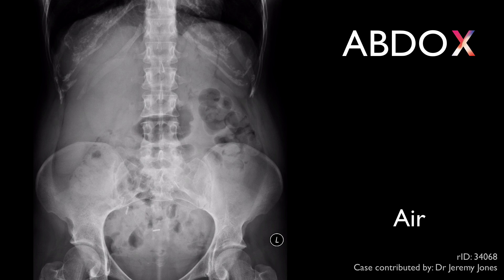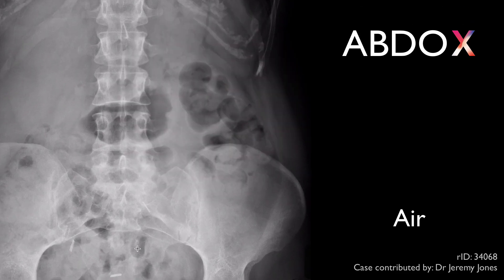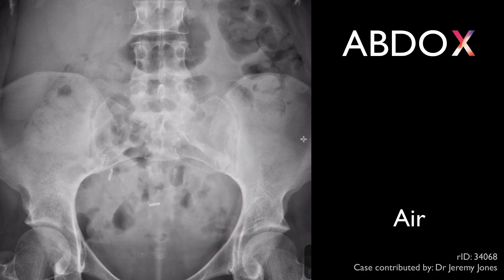A stands for air. Air should only be seen within the lumen of the bowel, such as here within the large bowel, and here within the small bowel.